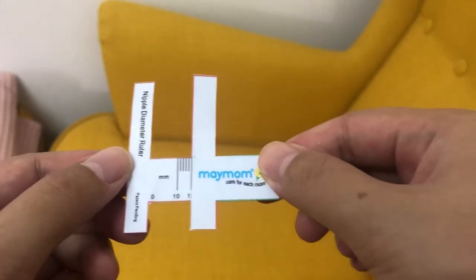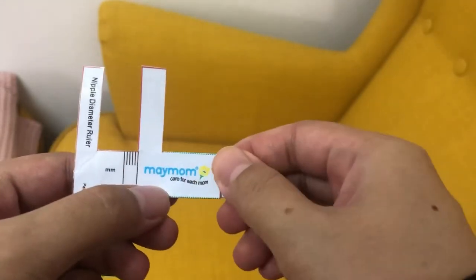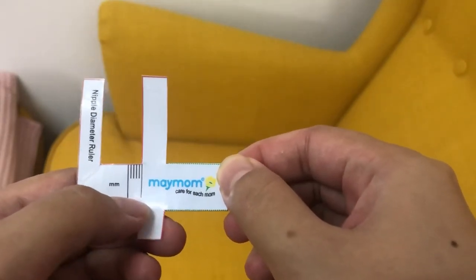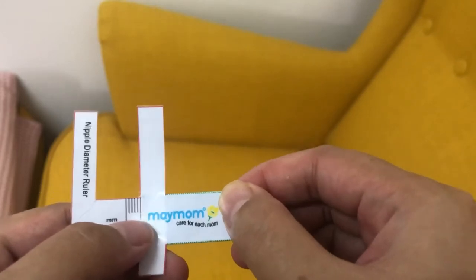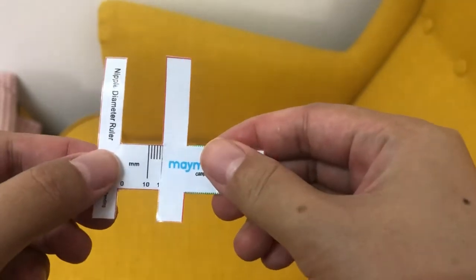Alright guys, this is what you call a nipple diameter ruler. This is actually designed by May Mom. I'm going to link the PDF down below so you guys can make this yourself at home. And in the second part of the video, I'm going to show you how you can make it yourself.